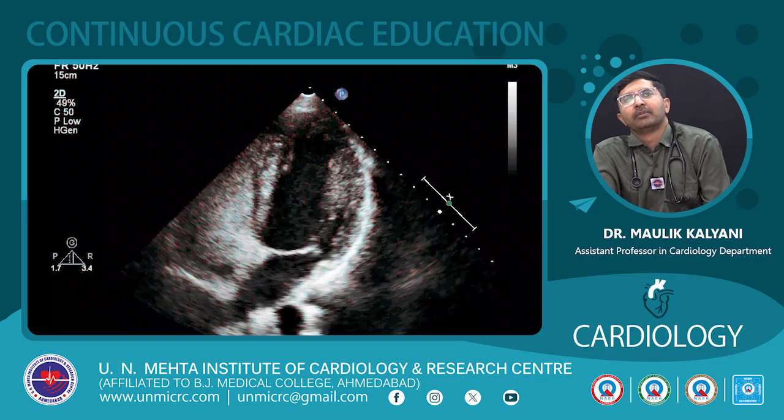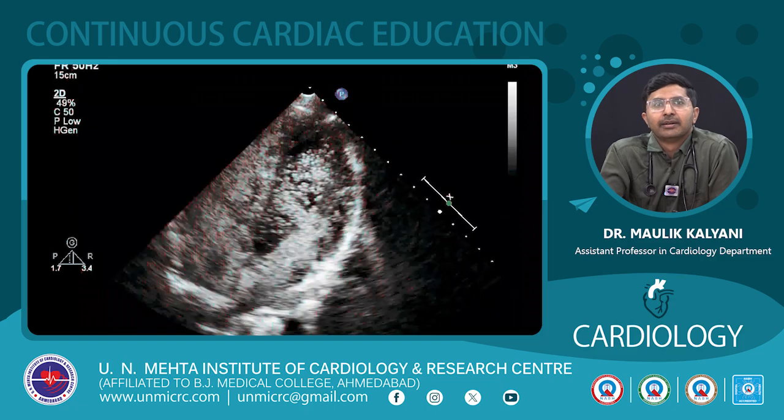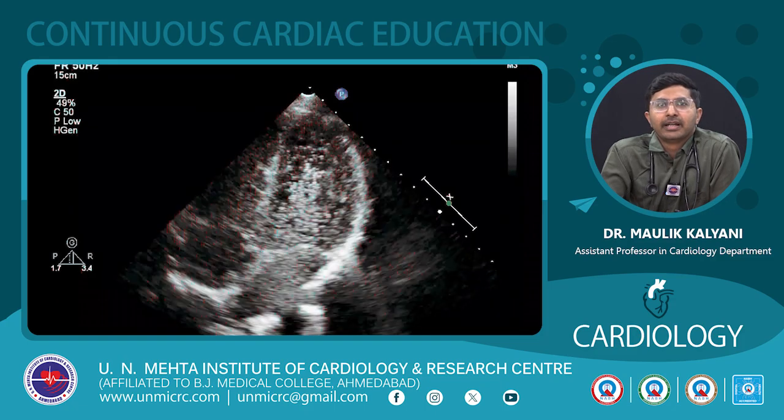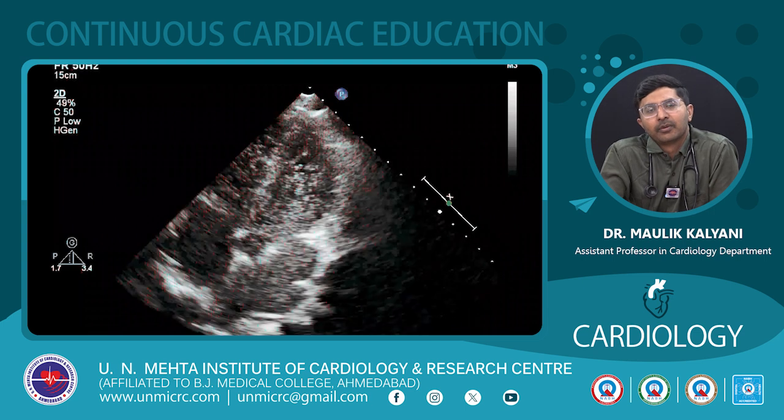So this is the video for that. As we can clearly see, initially the right atrium and right ventricle are opacified, followed by the left atrium and left ventricle, and the contrast is also disappearing from the RA and RV.